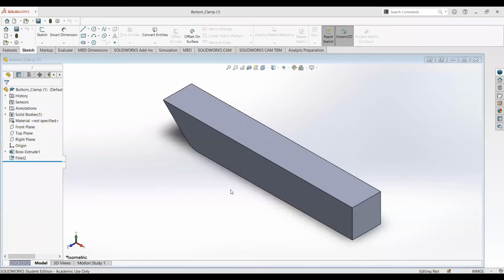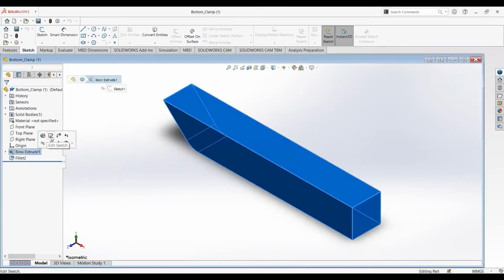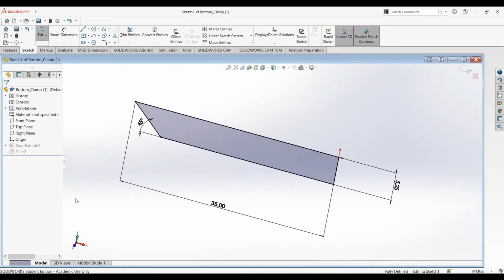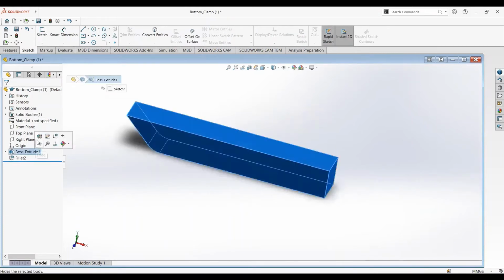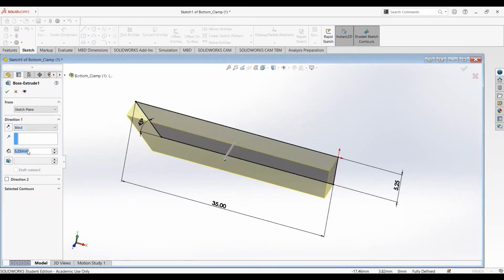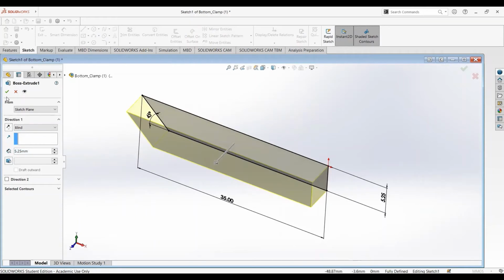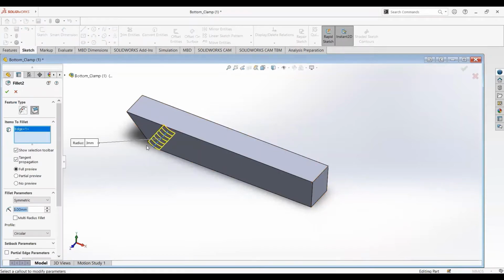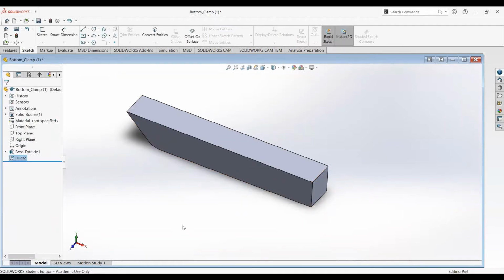Okay, so now I'm going to show you how we created our bottom clamp, which was pretty easy to create. So first, we sketched this shape. These are all the dimensions here, as you can see. And then we extruded this by 5.25 millimeter right here. After that, we just use fillet to make the sharp edges smoother right here. And that's it for our bottom clamp.